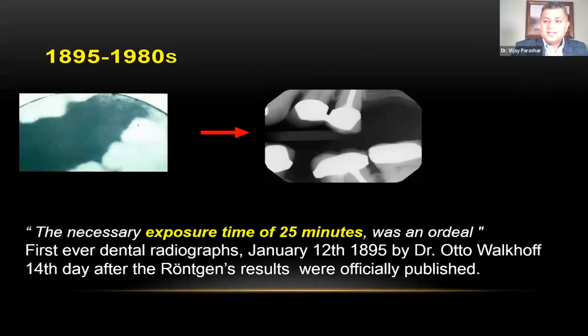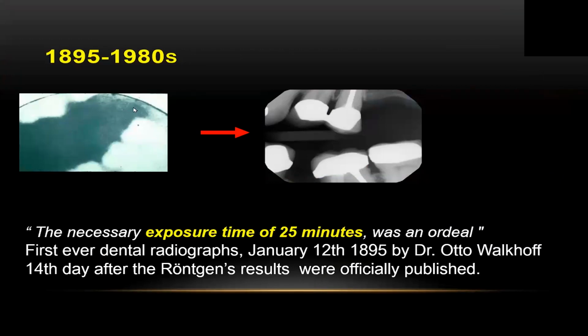Let's start with the beginning. On the left of your screen is the first ever dental radiograph. This was made by Otto Walkhoff, a German dentist. He held a photographic plate in his mouth for 25 minutes, and this was the product.